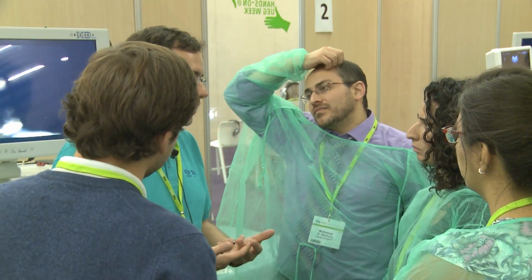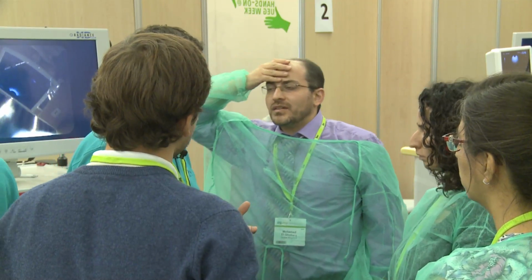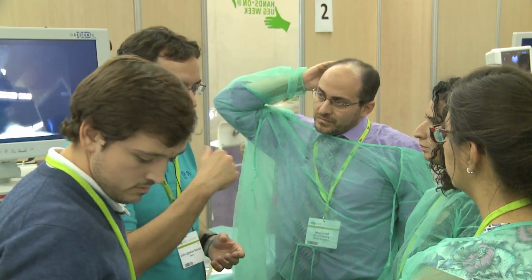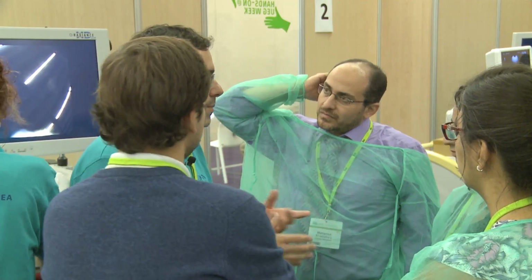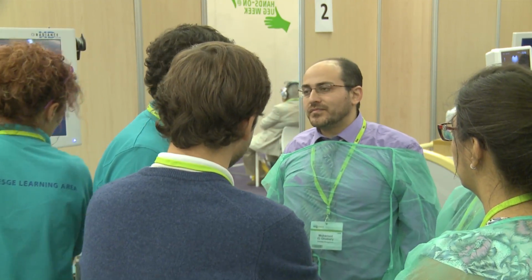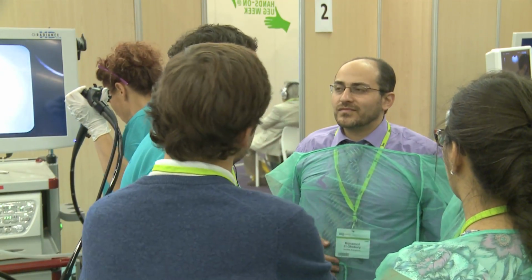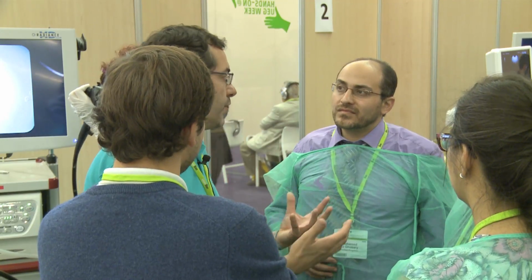The move in endoscopy is that all materials are single use. In the past, sometimes for ERCP we would just sterilize the sphincterotomes and use them in a couple of patients. I think today that is not acceptable, and we should have single-use systems for every patient. At the end, the companies are reducing the cost of this material, so it's possible. It's not a nightmare for the hospitals to buy those systems for all of the patients.